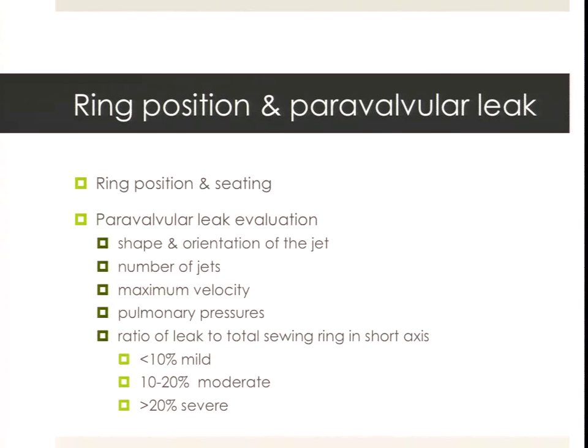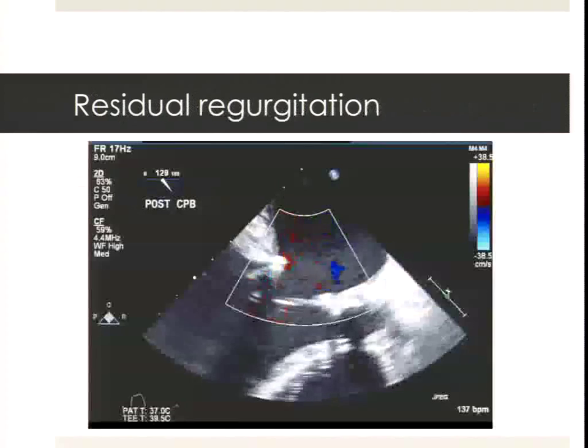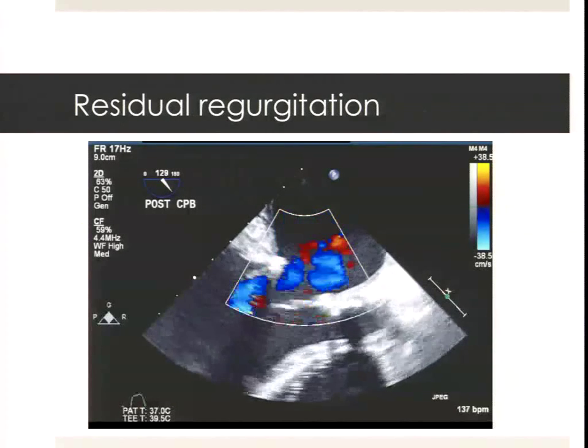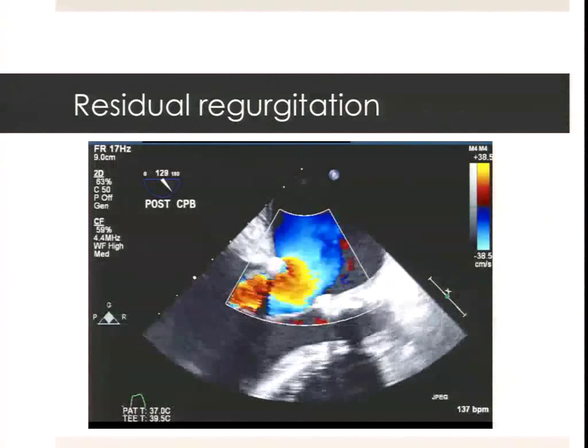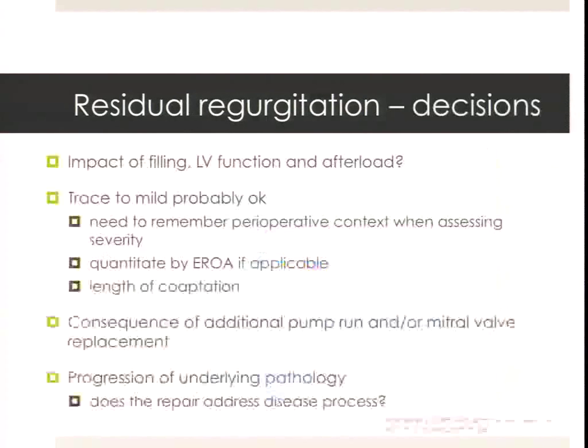There's a couple of broad rules on rates of severity, but it does come down to a fair bit of interpretation. So how much regurgitation is too much? Again, unfortunately, this comes down to a matter of interpretation, and these are the sorts of things that we want to look at.